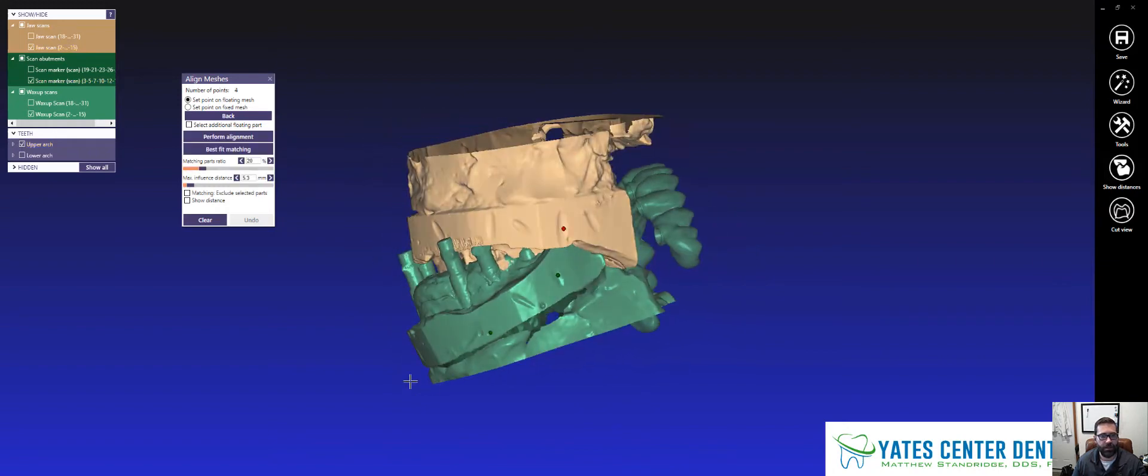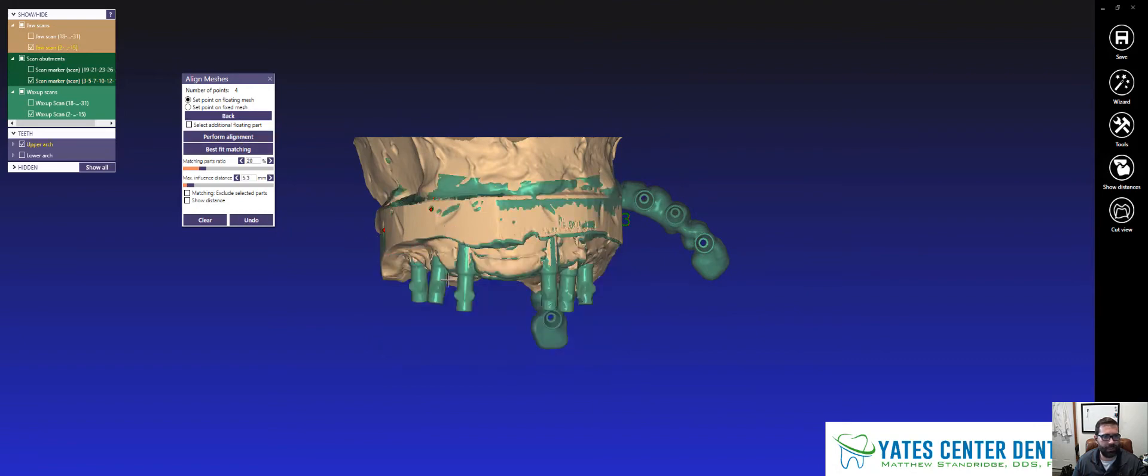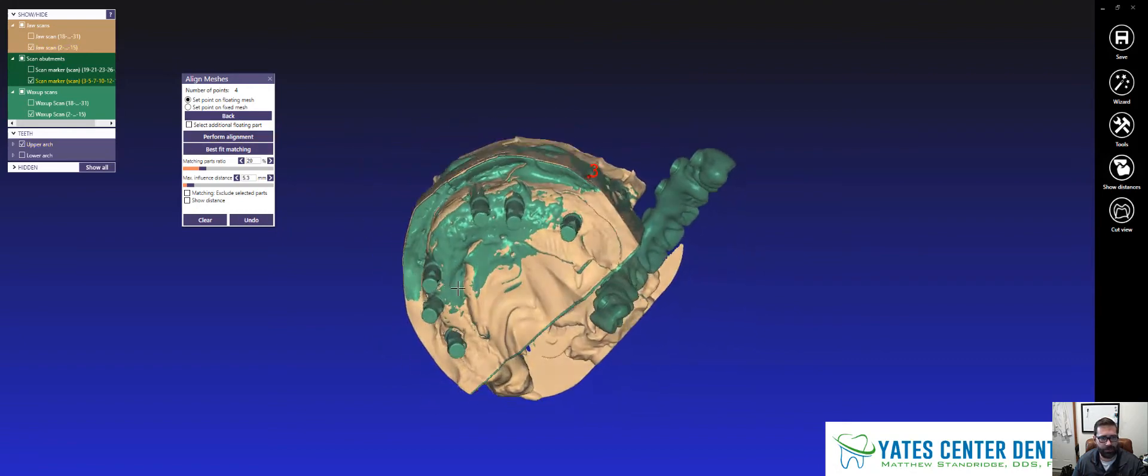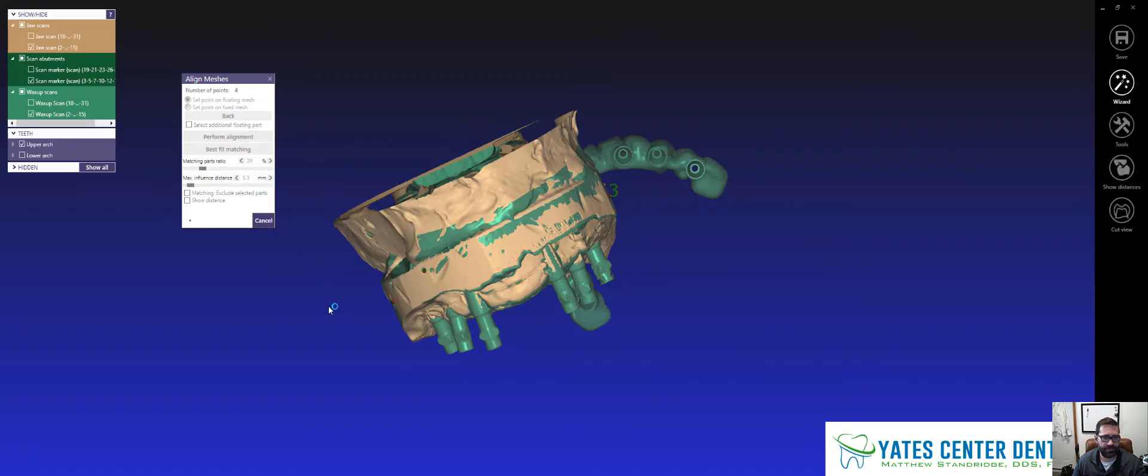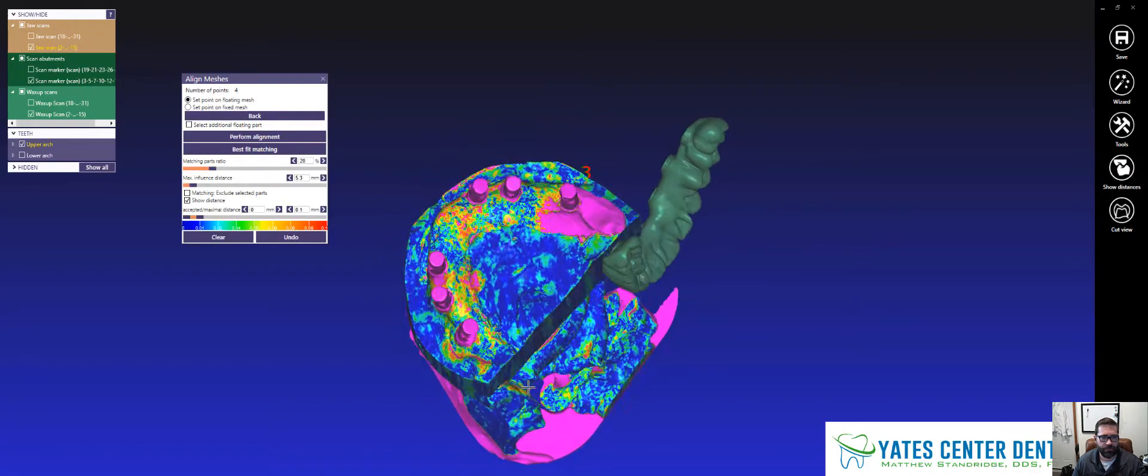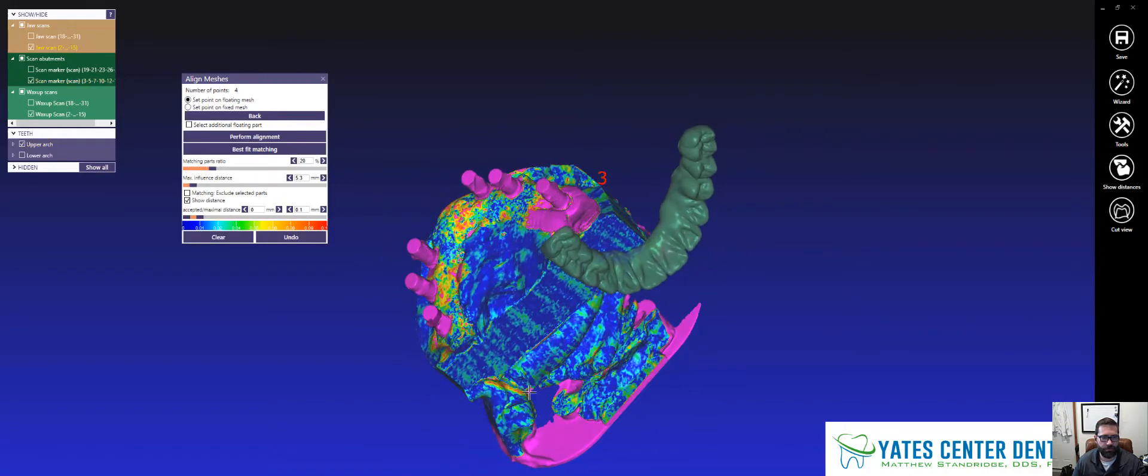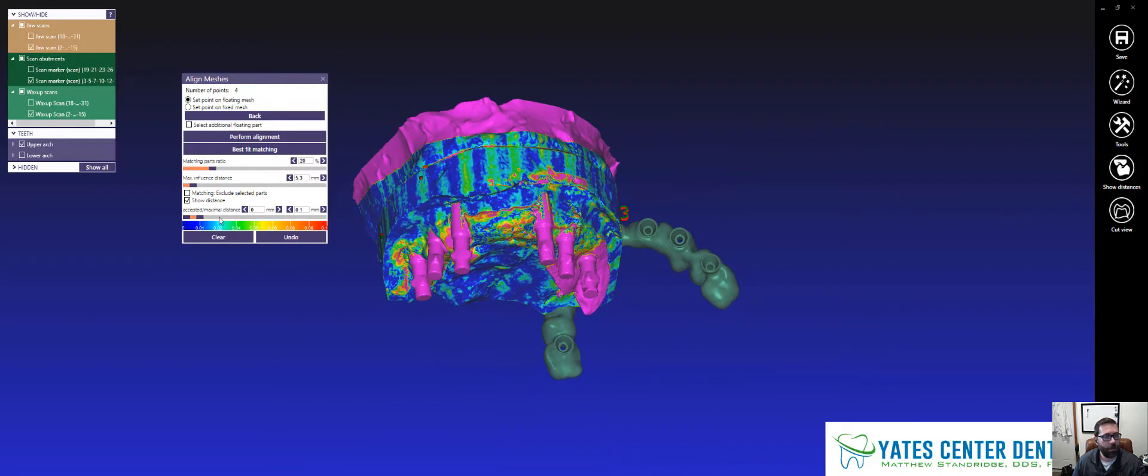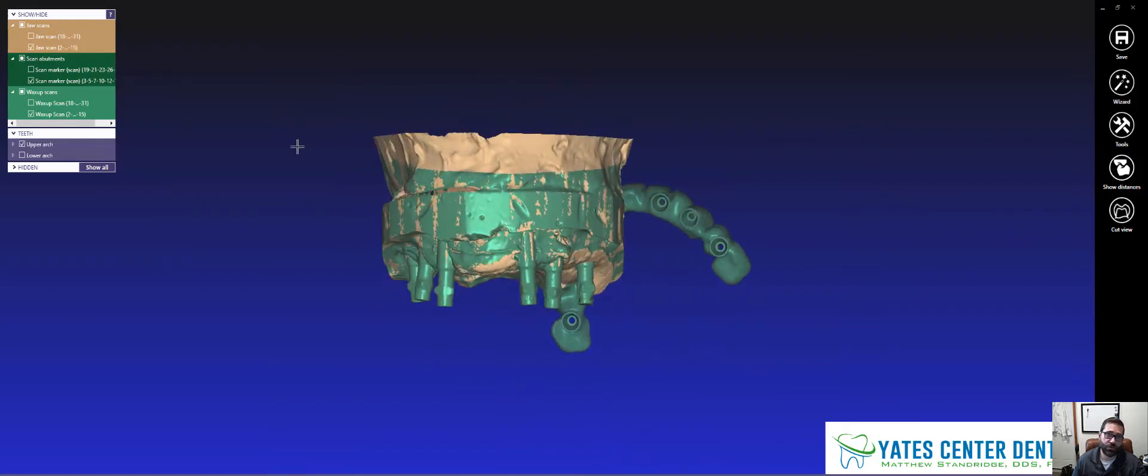And so on and so forth, right? Then we're going to hit Perform Alignment. And that looks pretty good. Always hit Best Fit Matching. You'll just fine tune everything. And there we go. So that's a pretty good mesh right there. That looks really good. Then I'm going to click out of that. And so those two are aligned.